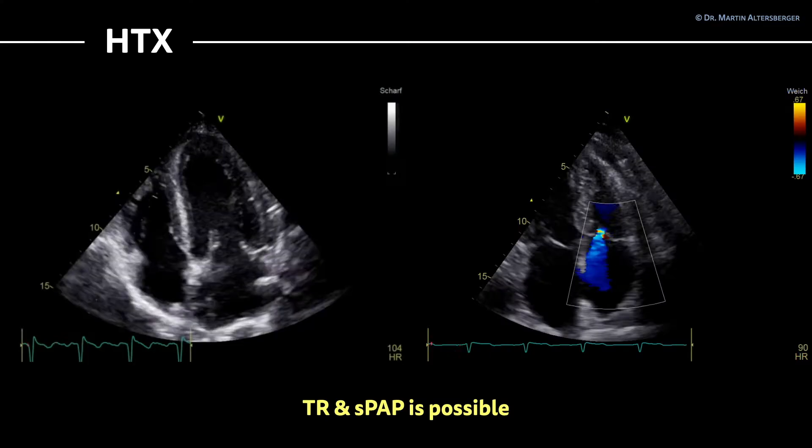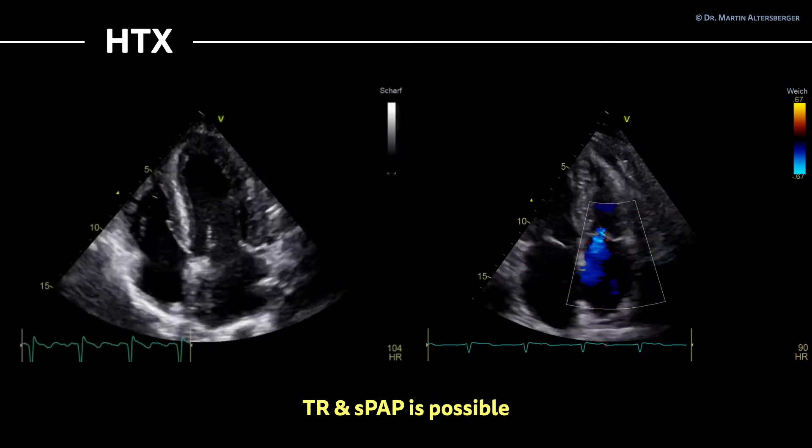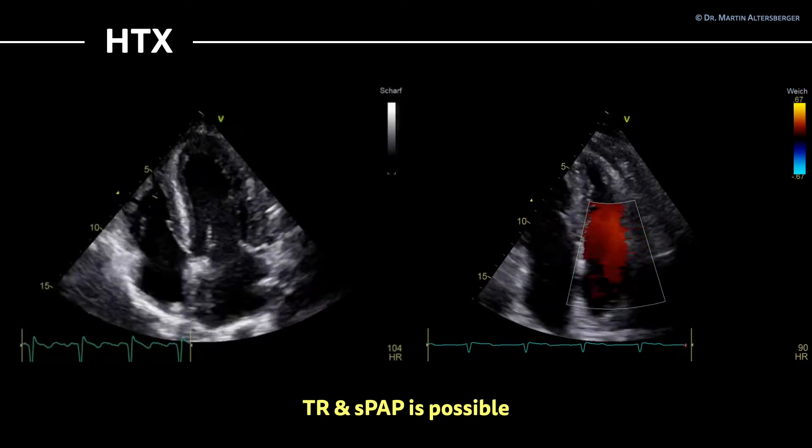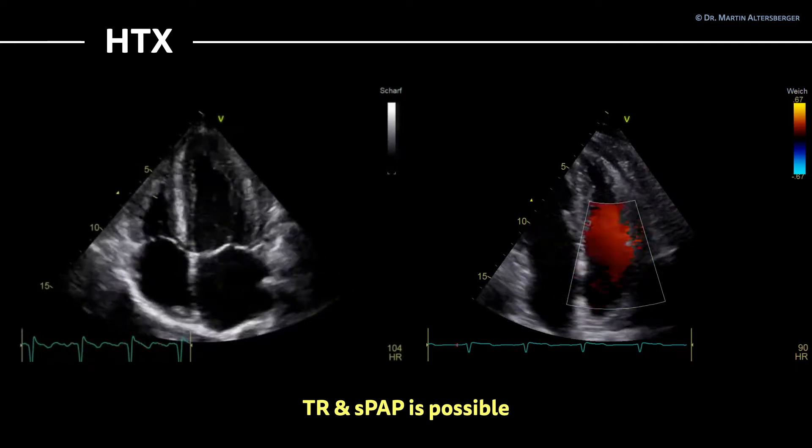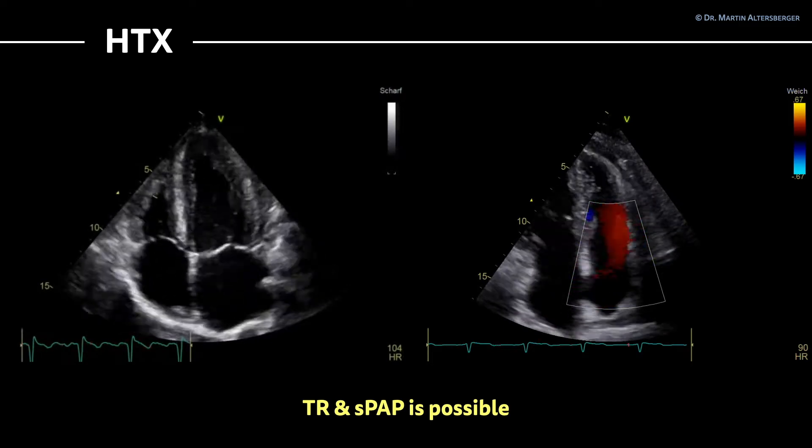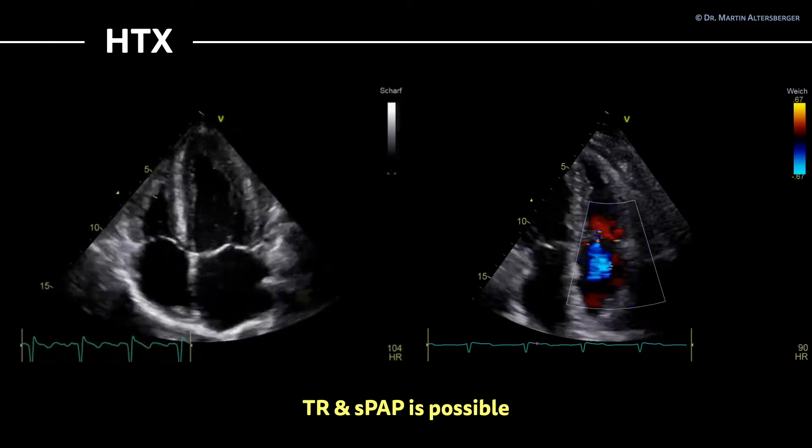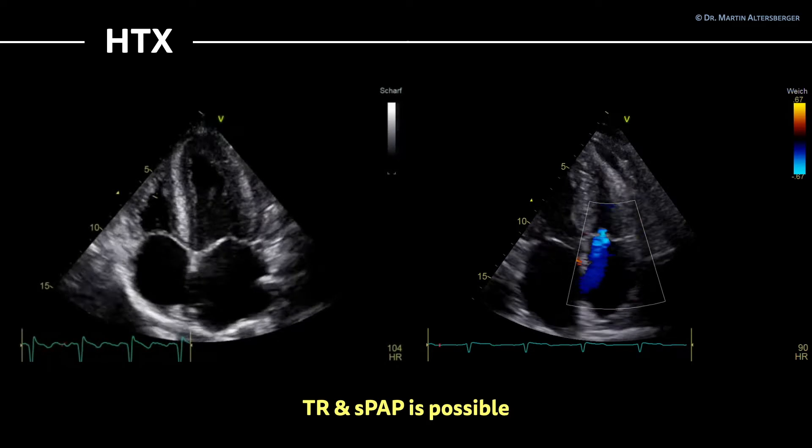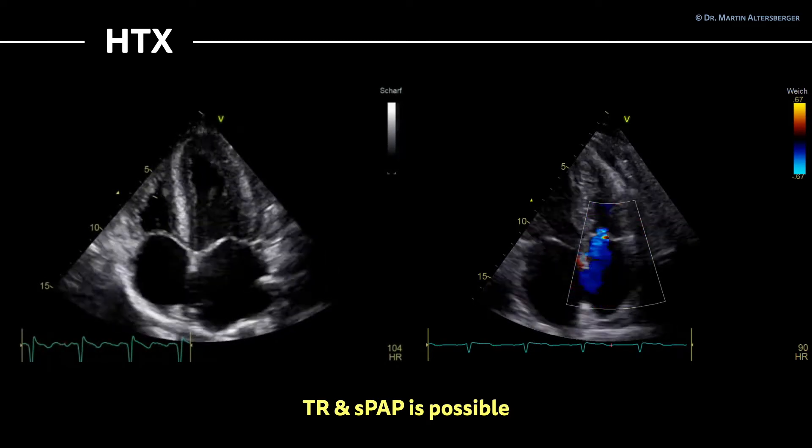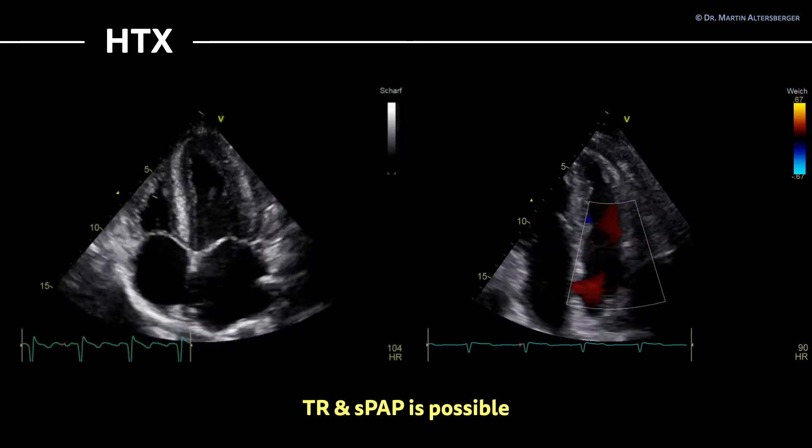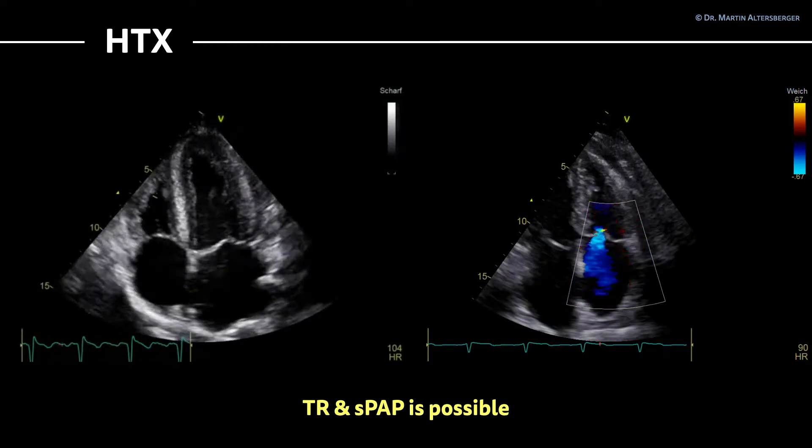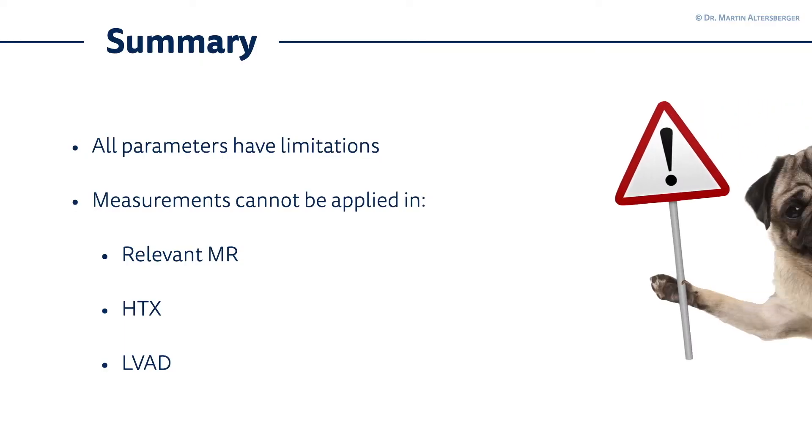But there's one measurement you can actually do, and that's the tricuspid regurgitation and the systolic pulmonary arterial pressure. If you have a proper TR signal, as seen in the right side - the image is a bit turned around, it's an atypical apical view of the right ventricle and you see TR. When you have that, you can measure TR and the peak velocity and therefore calculate systolic pulmonary arterial pressures.